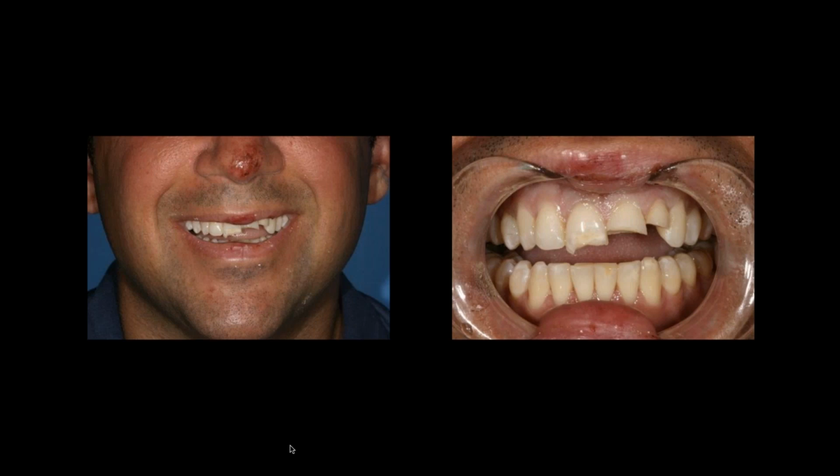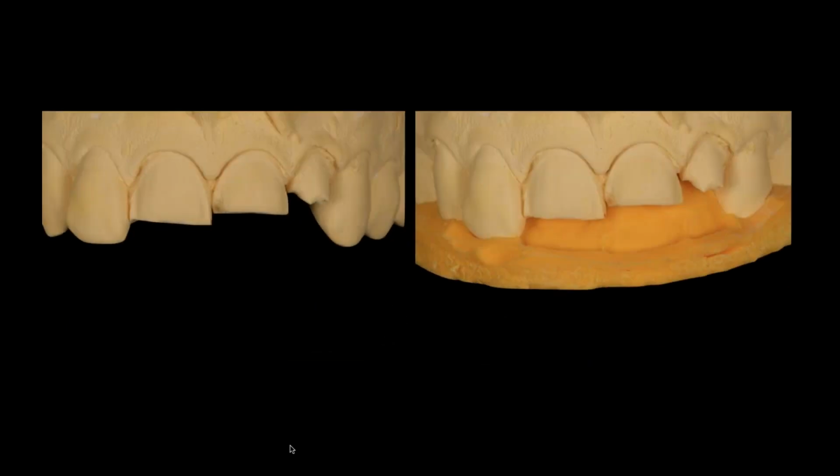I don't want to weaken the tooth by cast posting, coring it, or root canaling it more than it's already been done, to be honest with you. It's already self-root canaled by smashing it on the floor. But the last thing we want to do is start hollowing out that root and taking away more tooth structure. But challenge for us now: how do you manage that space? And this probably is the most difficult thing to understand. Opacity is that, 5 millimeters of unsupported ceramic that's going to be there. Aesthetically, the challenge is what ceramic do you put there?